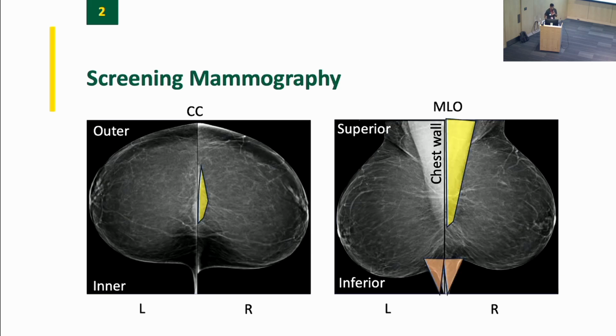Okay, cool. So a couple of things that are needed. I'll just talk about this really quick just so you have an idea. So the chest wall, these are the things highlighted here, the things required to make a valid mammography image. You don't really need to know this as far as using these images, but just suffice it to say that there are certain quality criteria that make something a valid mammography image, which lends itself really well to machine learning because all of the images are really, really similar.